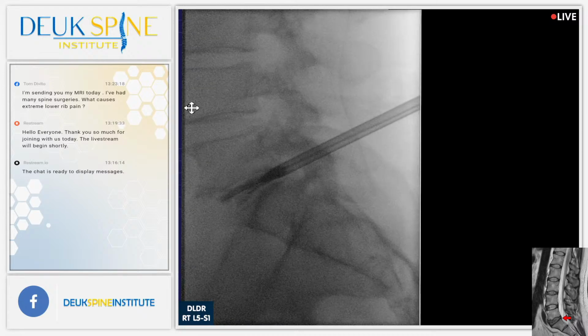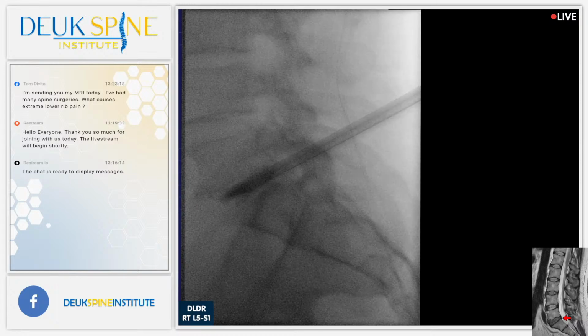Why don't we go ahead and take the guide wire out? Shot. We are in like Flint. We're good. We're good. Yeah, we're good. This is the worst part for the patient because this is where all the pain comes from.